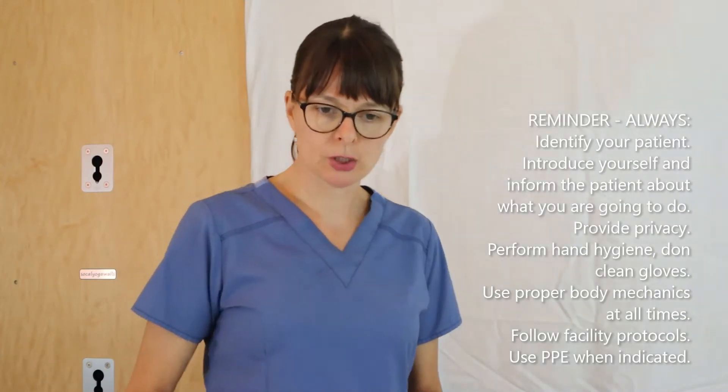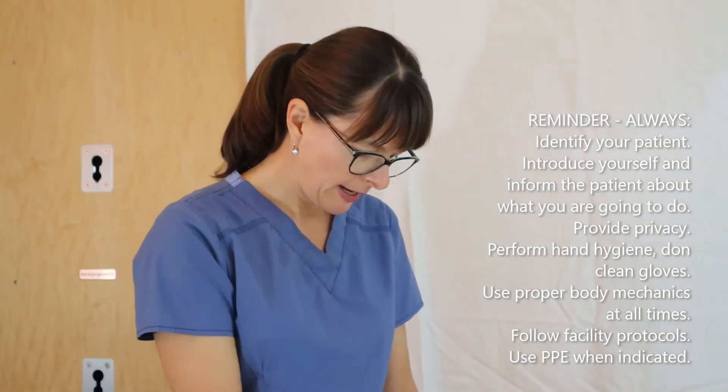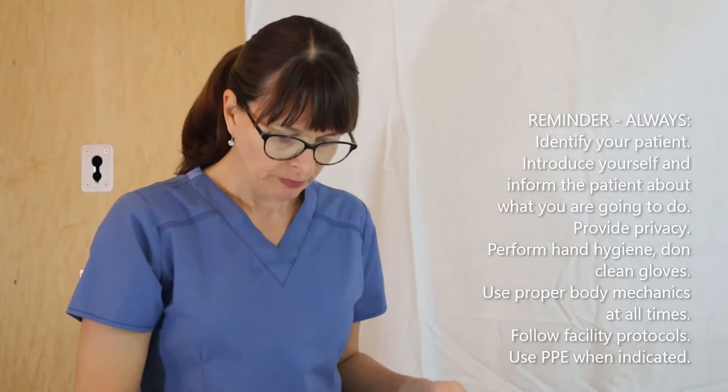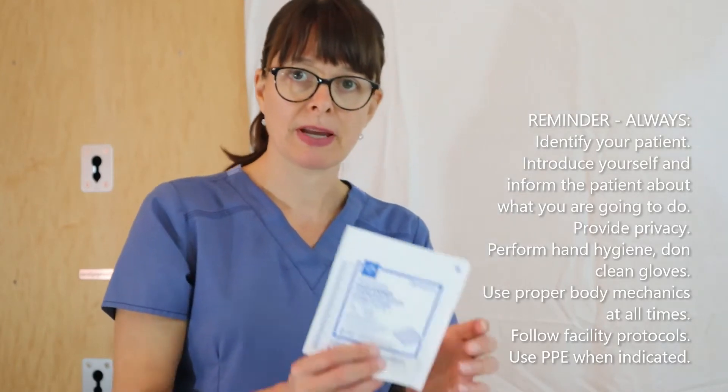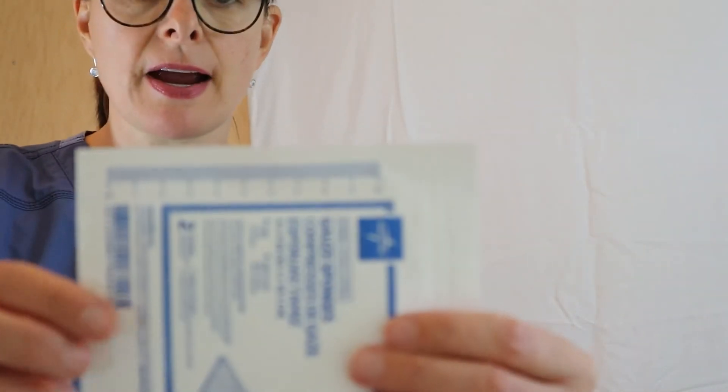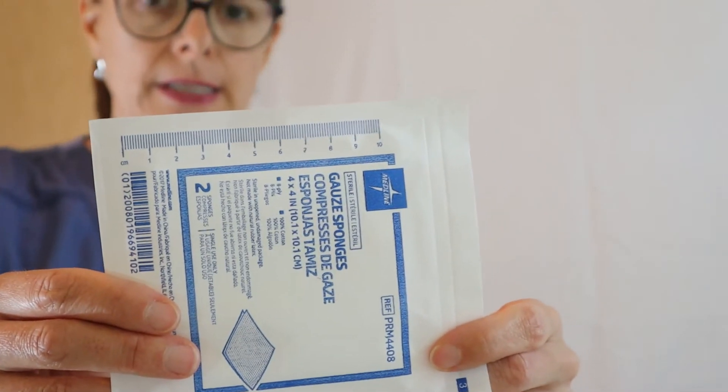Once the old dressing has been removed, you want to make sure that you have all the supplies that you could possibly need right there at the bedside so you don't have to leave the room or call for help. I like to bring either a dressing change kit and then also maybe some extra gauze. This gauze is nice because on the side it has a little tip measure so you could use the wrapper to measure the wound if needed. I also like to bring an extra pair of sterile gloves as well as some cleaning swabs just in case something happens or the kit doesn't supply everything that I need.